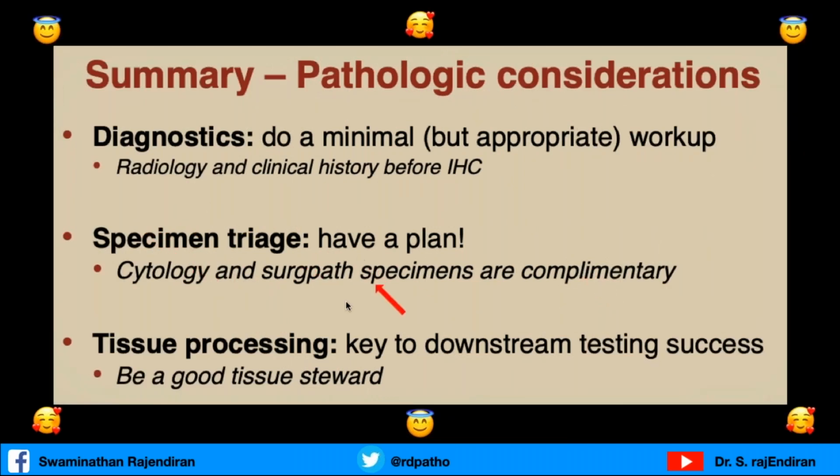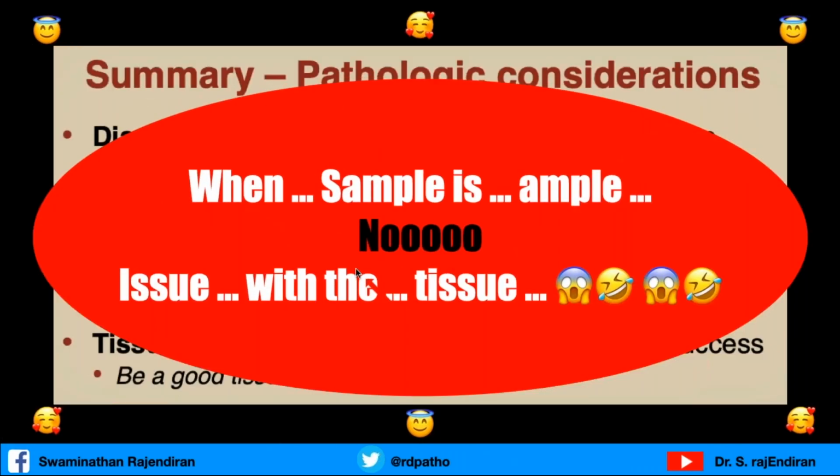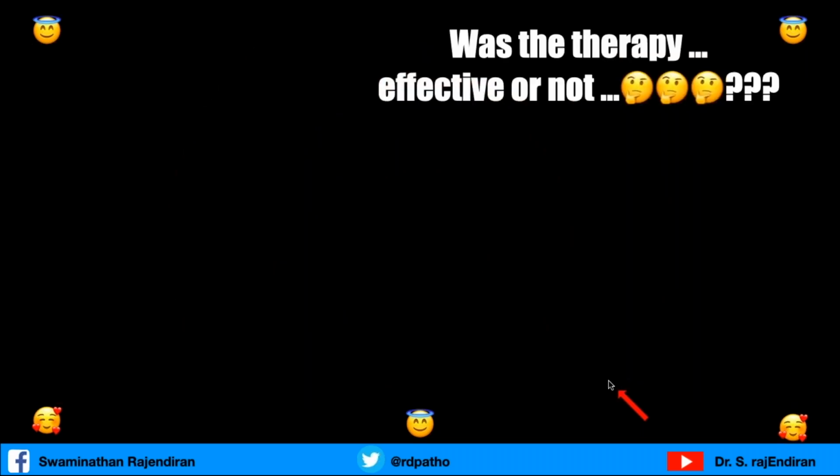So we have to handle the sample very, very carefully. When the sample is ample, no issue with the tissue. But when the sample is small, we have to be very careful in handling.